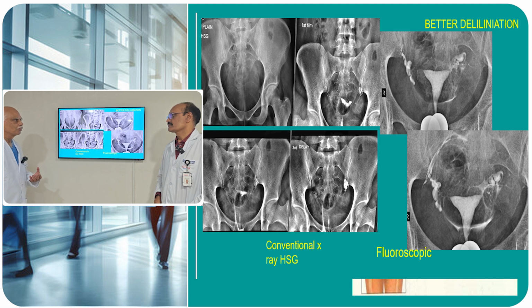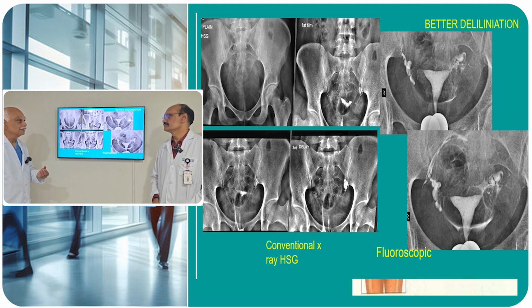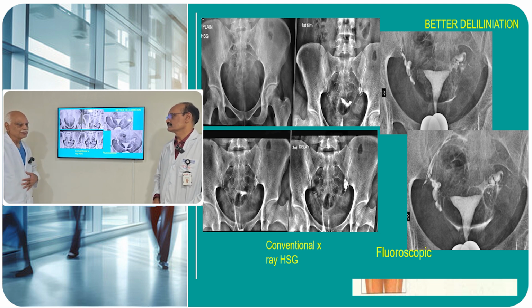But when we do it under fluoroscopy, we check for any problem in the pelvis. In just a few seconds, fluoro will show any abnormality, any radiopaque densities in the pelvis. So we reduce the radiation. That is one way the radiation is reduced. Here, this procedure is a blind procedure. You inject a contrast media and take spots. You are not seeing how the contrast is entering the uterus, and how it is coming out through the fallopian tubes, opacifying them.